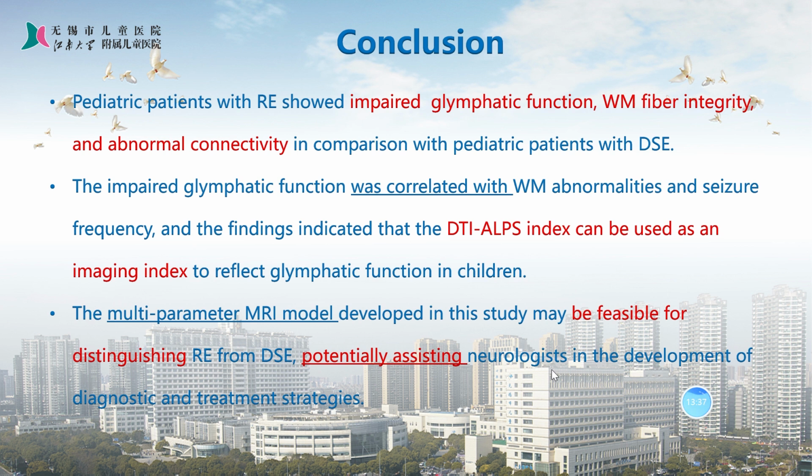Third, the multi-parameter MRI model developed in this study may be useful for distinguishing RE from DSE and potentially assisting neurologists in the development of diagnostic and treatment strategies.